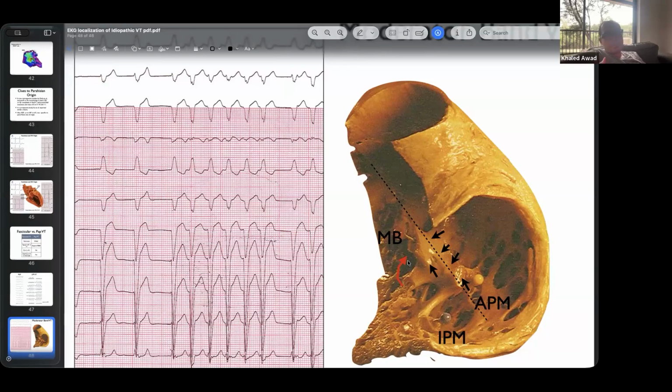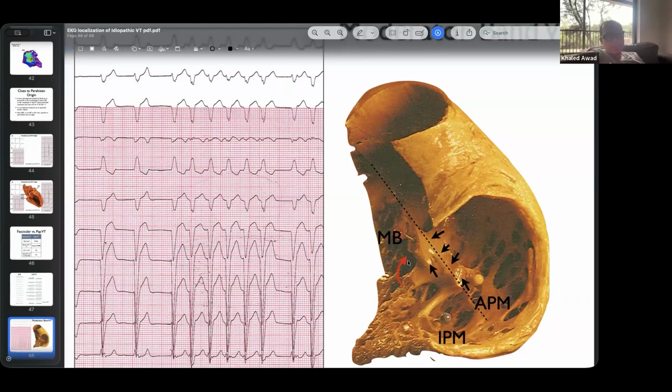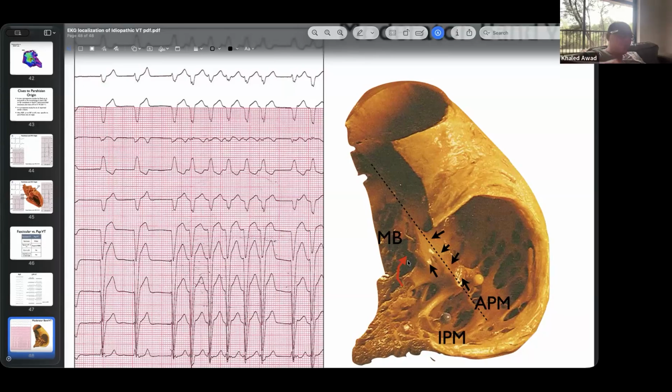So don't put grounding patches near the heart. Put them on the legs. If you have two, look at your opening impedance before you start ablating. If it's low, like 90, don't ablate with an opening impedance of 90. Disconnect one of the patches. And then you reinforce your lesion with surrounding points. You want to reinforce it a little bit, put an extra application in each direction. And I wouldn't do just one point and run.